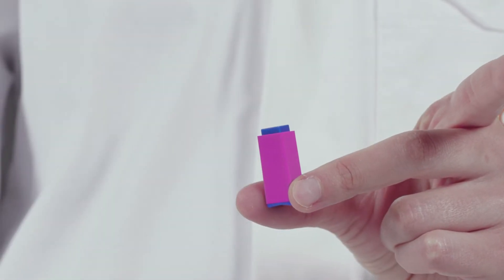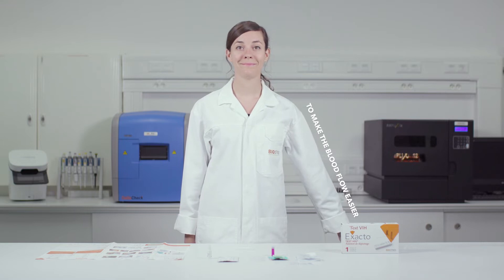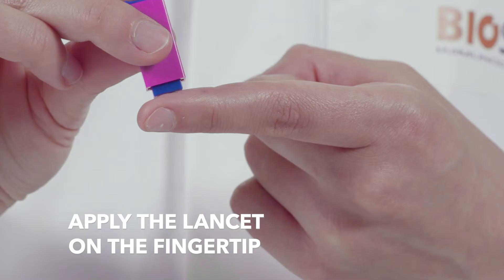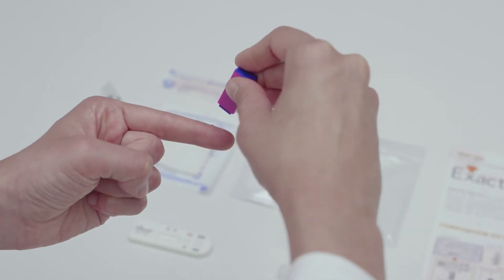Remove the cap from the lancet. To get the blood flowing easier, let your arm hang down by your side. Position the lancet on your fingertip and press the activation button while pressing firmly on the other end.